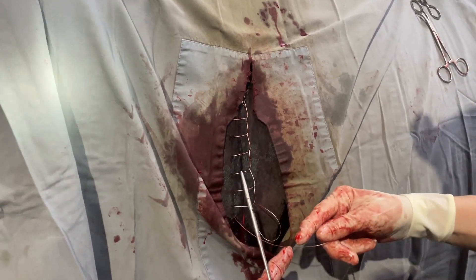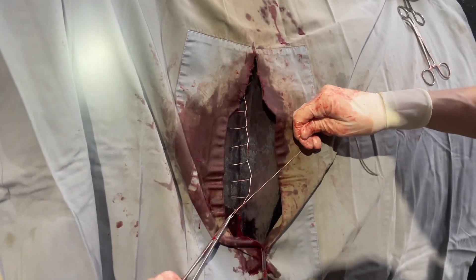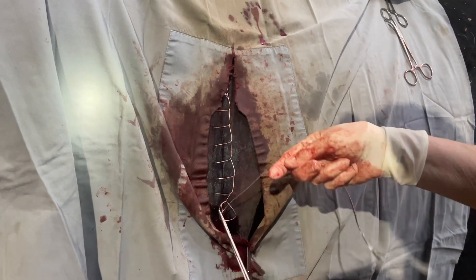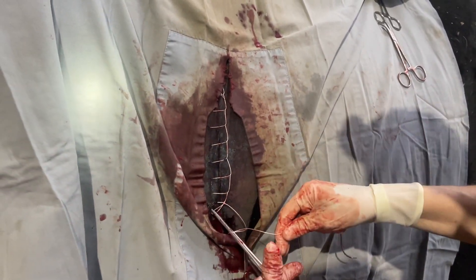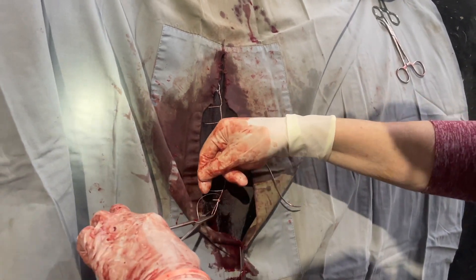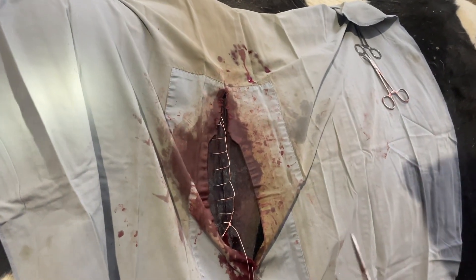Skin heals end to end, so we have to make sure the ends are exactly opposing — we don't want them rolling under or rolling out. She'll have a little naked area here for a while, and these stitches will not dissolve, so they'll have to be cut out in a couple of weeks.